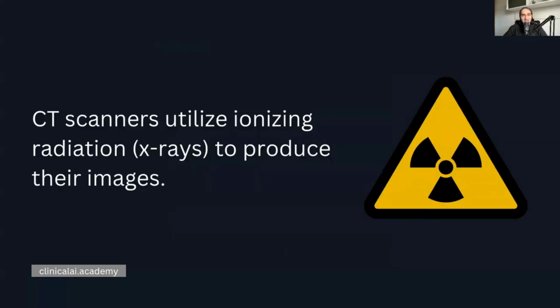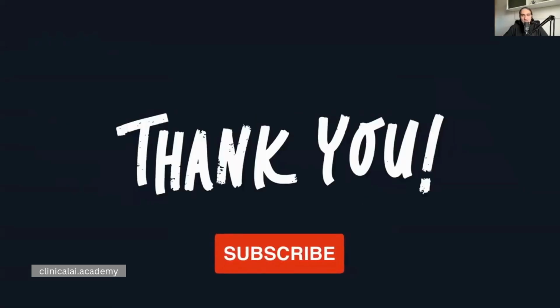Finally, CT scanners are widely used, but they utilize ionizing radiation to produce their images, similar to conventional radiography. X-rays cause mutation, and they are teratogenic at times such as pregnancy. That is why it's always important for the radiologist to talk to the patient before the examination, make sure that a female patient is not pregnant, and that the patient understands the risks and the benefits of the examination. I hope you benefited from the information presented, and I thank you for your time.